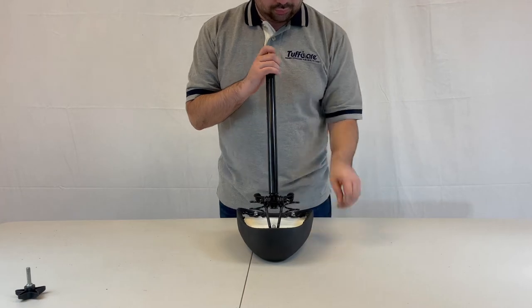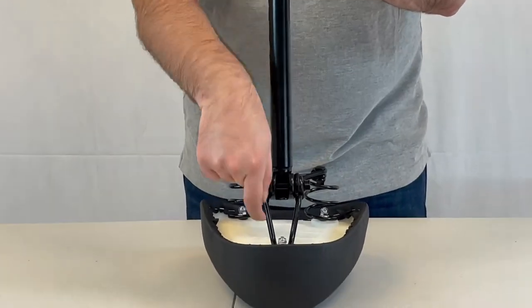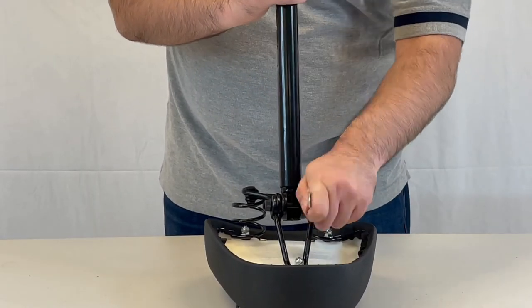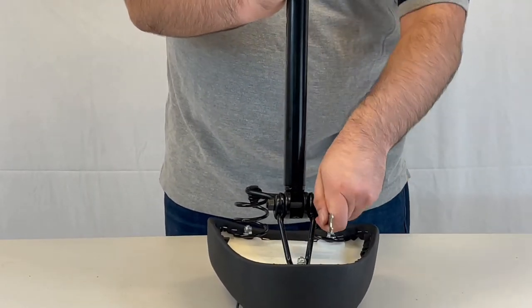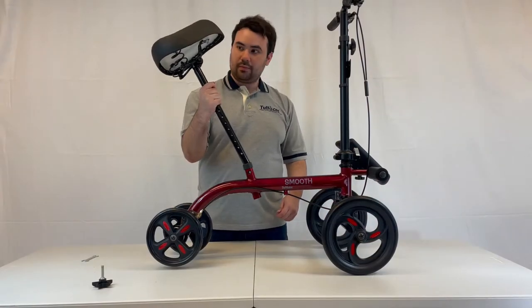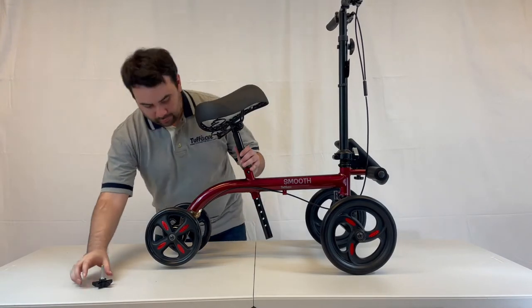To mount the seat onto the seat post, it is important to tighten the nuts on both sides of the seat mounting hardware. Place the seat post onto the mainframe and align the holes in the post to the desired height.